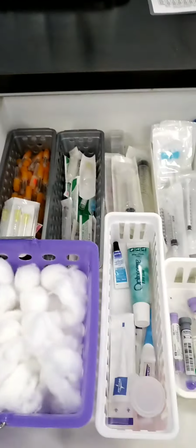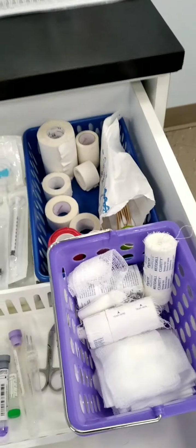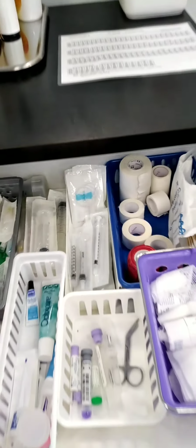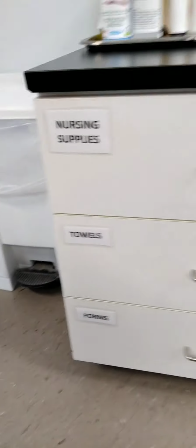We also have a table that contains all of our nursing supplies. So if I were to open this, it has cotton and needles and some syringes and some eye lube and thermometer and covers, some blood tubes, anything that you might potentially need in terms of nursing, except we don't do that much in this room. The drawer below has some towels and then some forms on the very bottom. And that already brings us full circle.